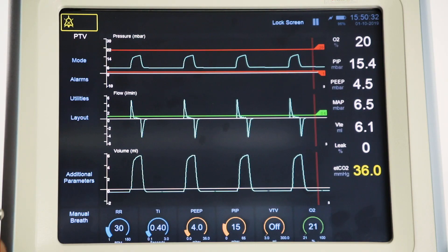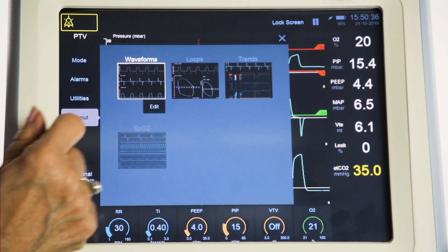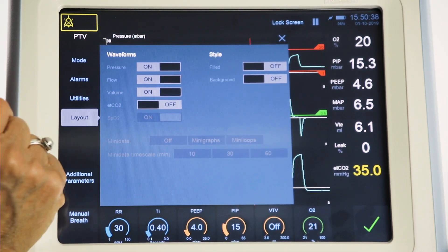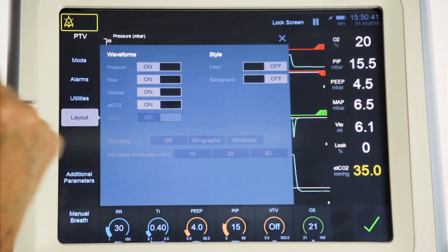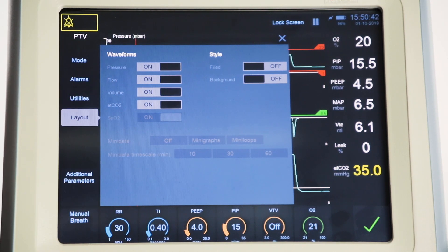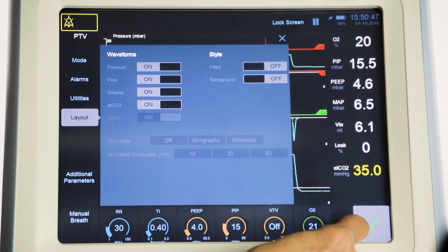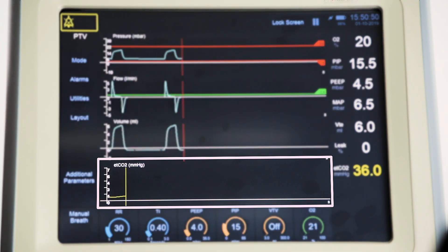To display the capnogram waveform, go to the layout menu and select the waveforms button. Then select the edit button, turn on the ETCO2 waveform, and press confirm. This will add the capnogram waveform to the fourth channel on the screen.